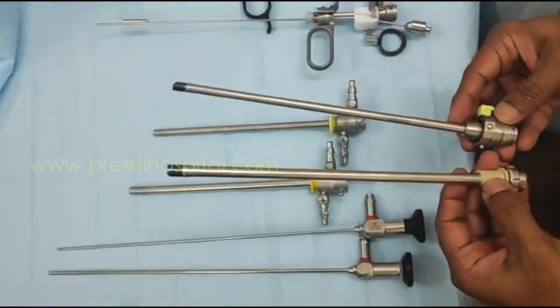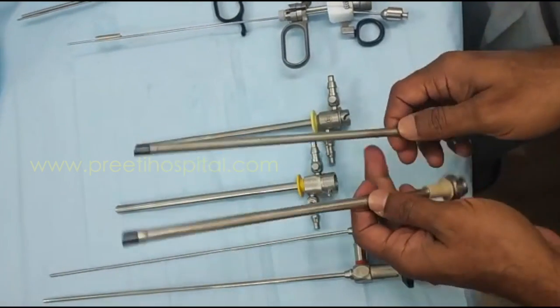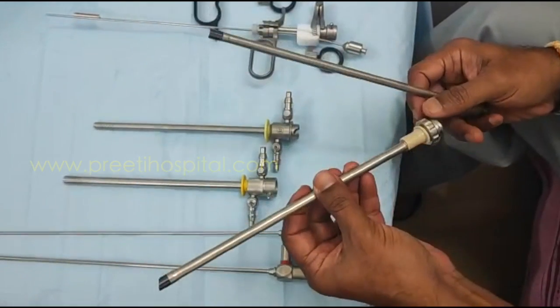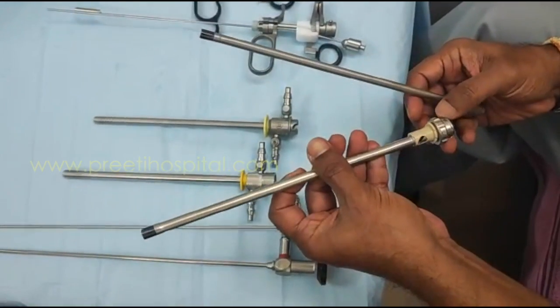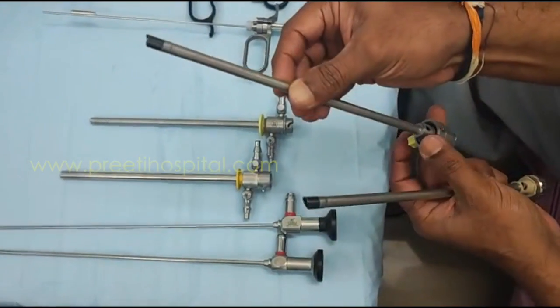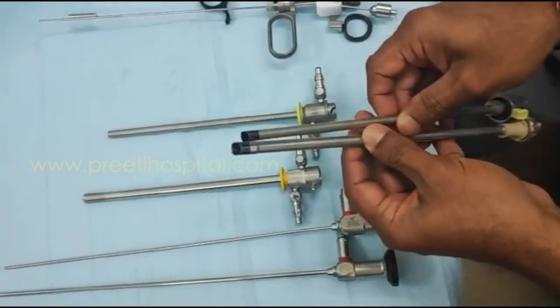This is in fact a rotatable sheath. You can clearly see the difference between the two. This one is approximately 20 French, and this is 24 French. And this is 20 French, this is 24 French — you can see the difference here.